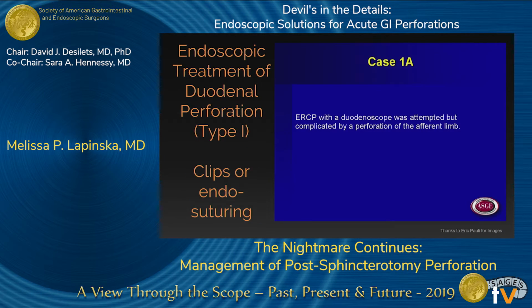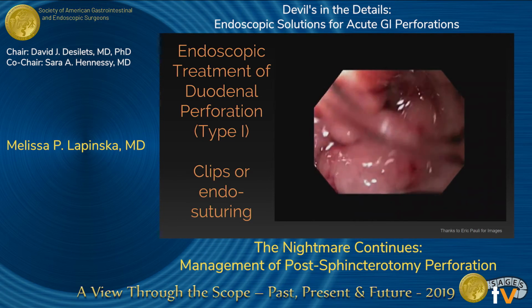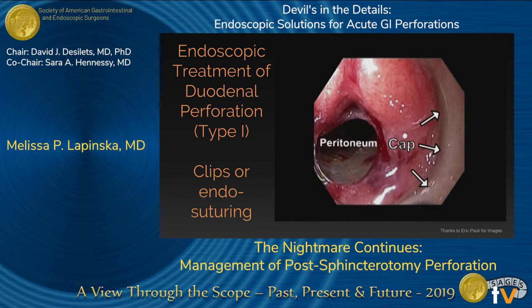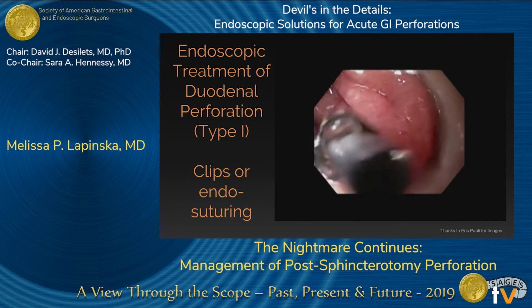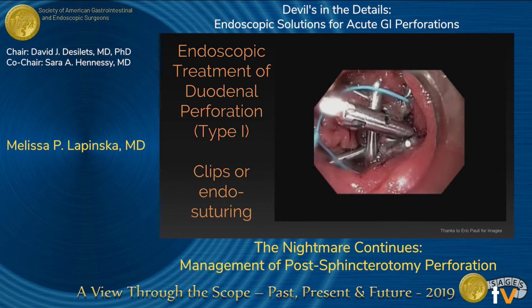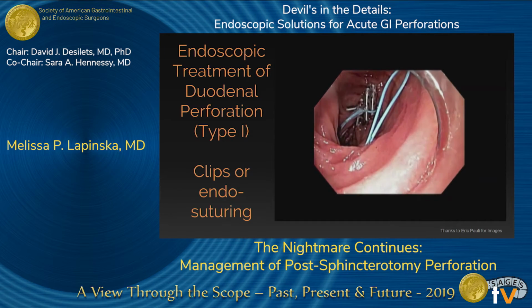So this is that lovely patient that has the Billroth reconstruction. Gorgeous example of a sort of duodenal, but probably really jejunal perforation because of the altered surgical anatomy. Altered surgical anatomy is obviously on the list of things that increases your risk, but that is the hole directly into the peritoneum. The cap is being used to facilitate visualization and retraction. You can see the clips coming down. You have already seen this technique described: starting at the end of the perforation, placing multiple clips in a linear fashion, and then using the through-the-scope endoloop equivalent to contain these areas together. And this, again, is thanks to Eric. I really appreciate his help with this.